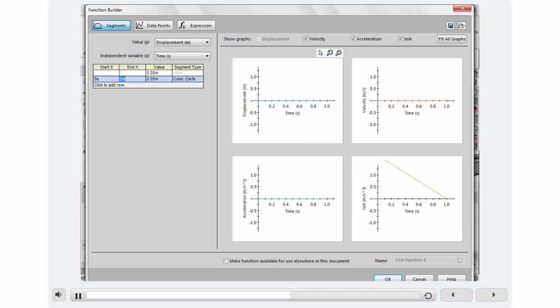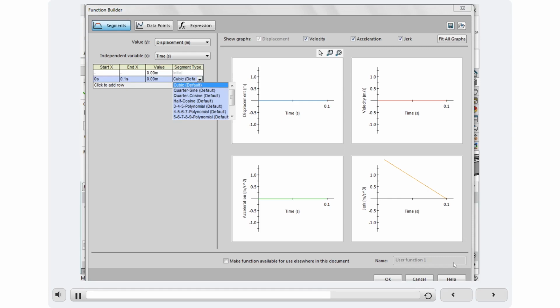Before entering values here, we must remember that a mate constrains the chair for the first 0.1 seconds of this simulation. The motor will be unable to move the chair while the mate is active. Therefore, we will specify 0 movement of the motor for the first 0.1 seconds. Retain 0 seconds in Start X column, and enter 0.1 seconds in End X column. Click to view the drop-down list under Segment Type, and set Segment Type to Linear Default.